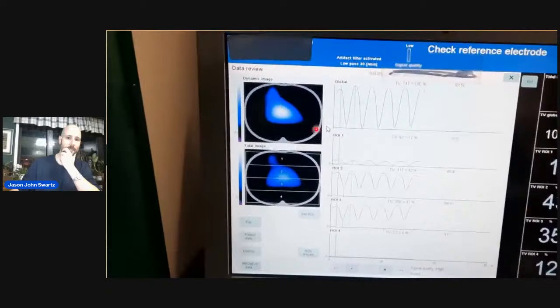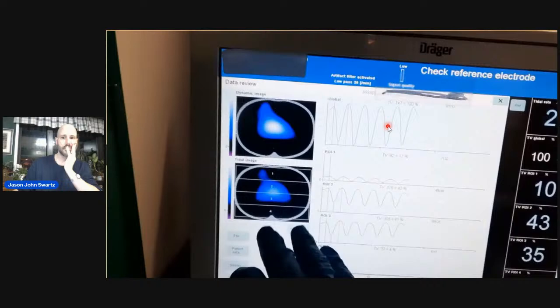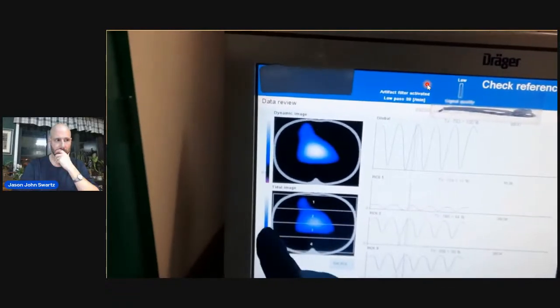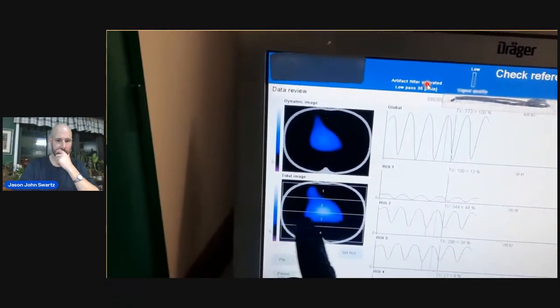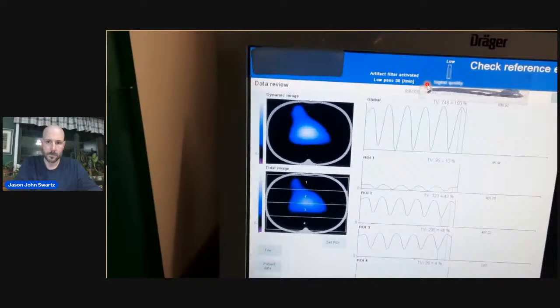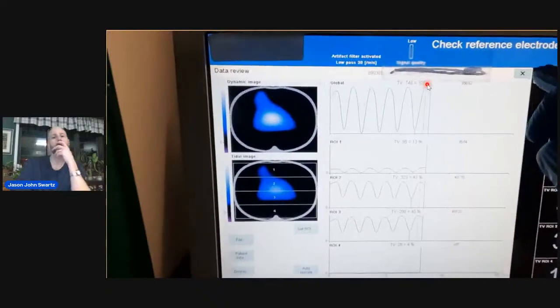So it's missing. This is what I was talking about, the distended abdomen and the extremely dilated colon. So we see that this is one of the patients in a supine position, and you can see increased pleural pressure and a complete elimination of aeration at the dorsal region. So we decided to flip the patient at the end of the shift. And here we are this morning, finally.